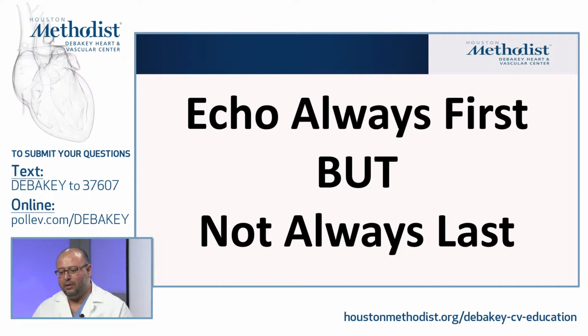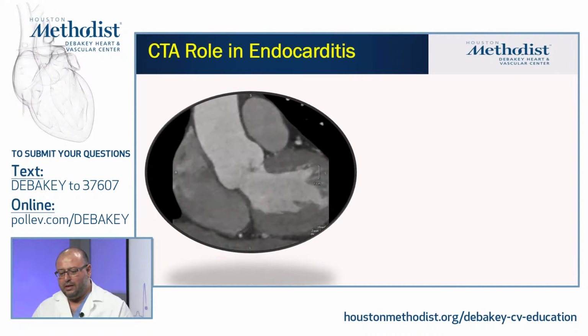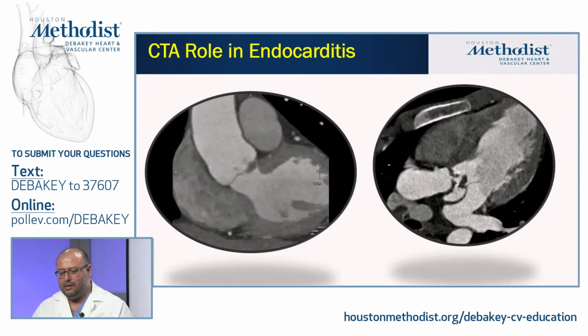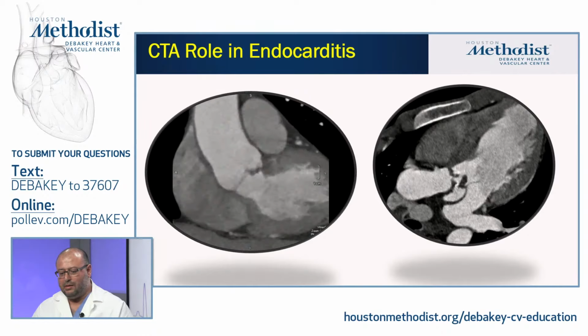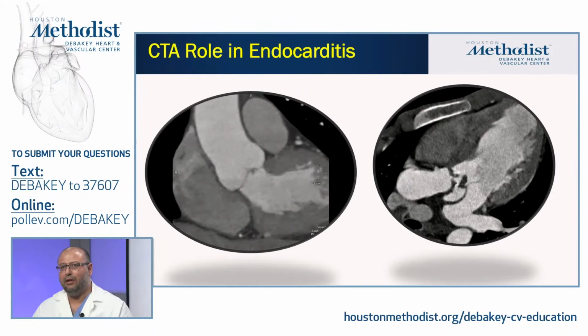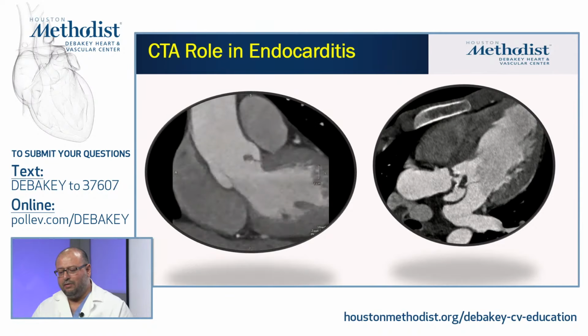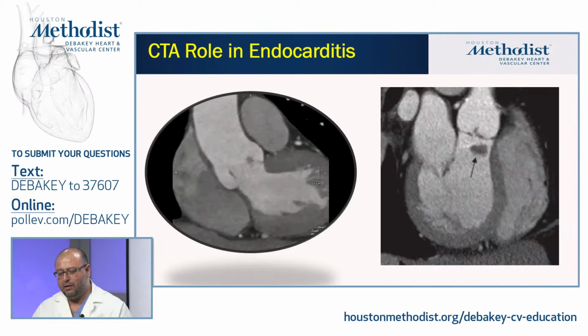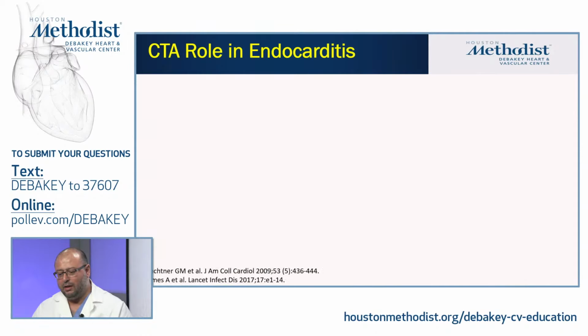So here's cardiac CT, and you can see that there is a vegetation on one of the leaflets of the aortic valve, and this can be easily seen by echocardiography. But most often this is sometimes an incidental finding on echocardiography. What we get referred for are more often the complicated cases where there is a fistula or an abscess to assess. And here's yet another assessment of the vegetation by cardiac CT.